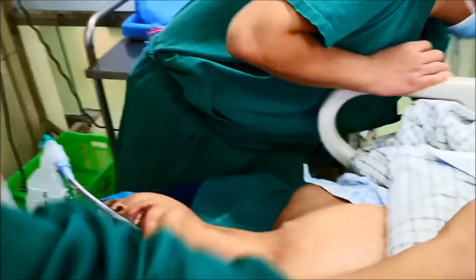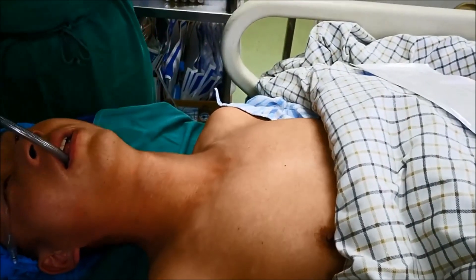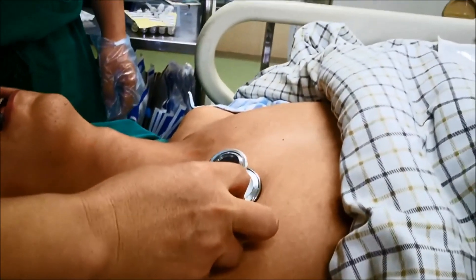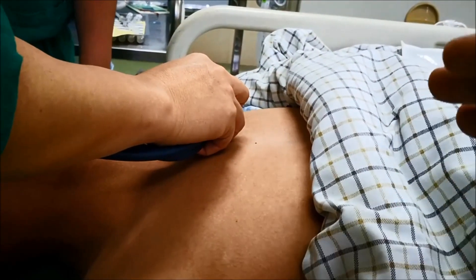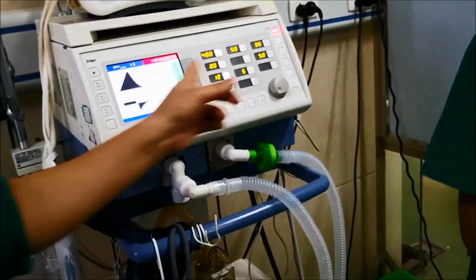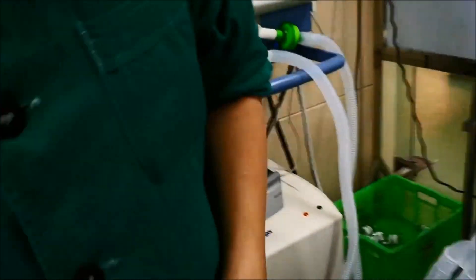Now, to check the patient's chest — we look at the patient's chest moving up and down, left and right, up and down, to confirm ventilation. We can also look at the monitoring system machine to check the shape and readings.